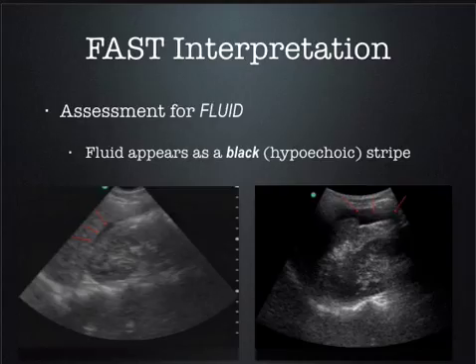What are we looking for? I told you, you're focused and oriented. We are looking for free fluid. All fluid is black in ultrasound. Fluid is always black. It doesn't matter whether it's blood, urine, pus, or ascites, it's all black.